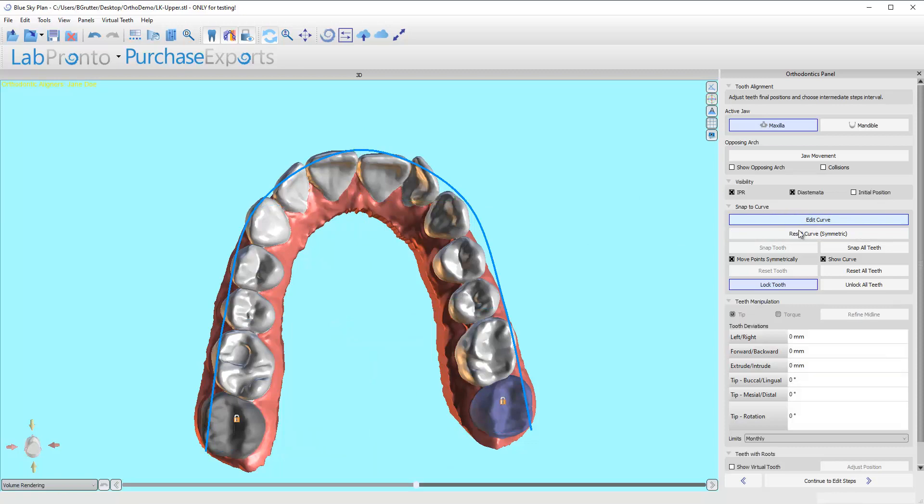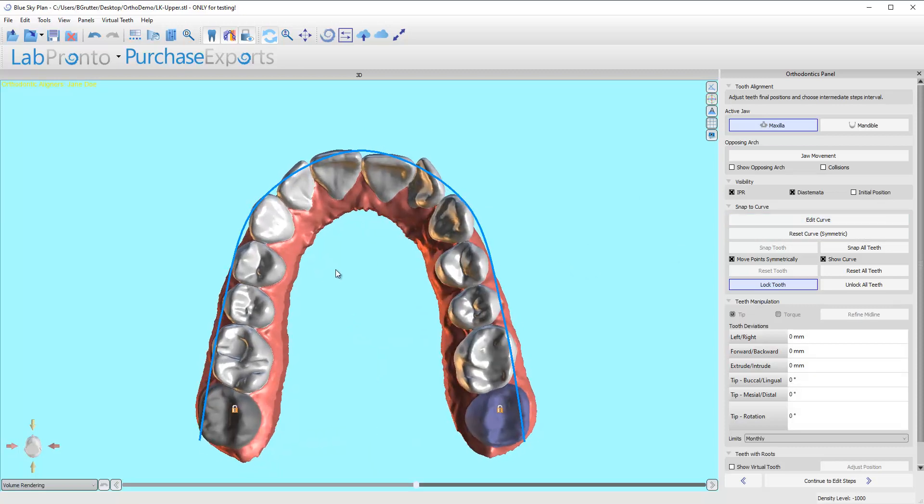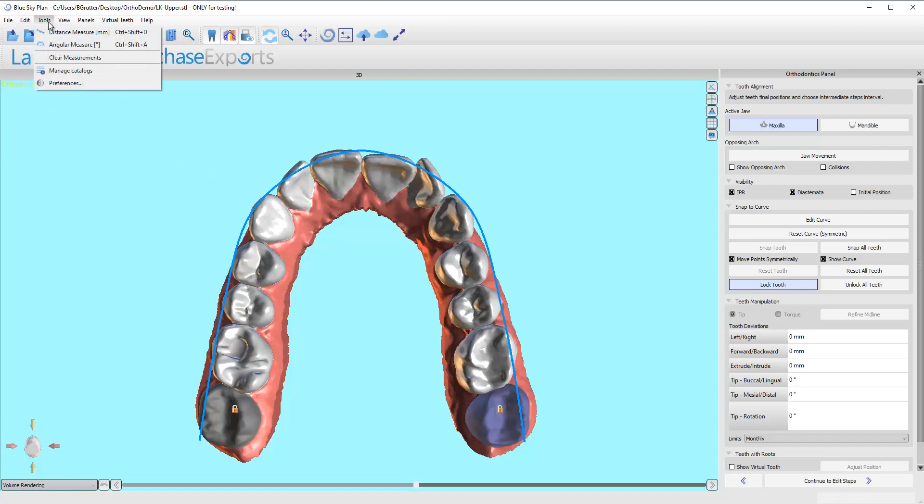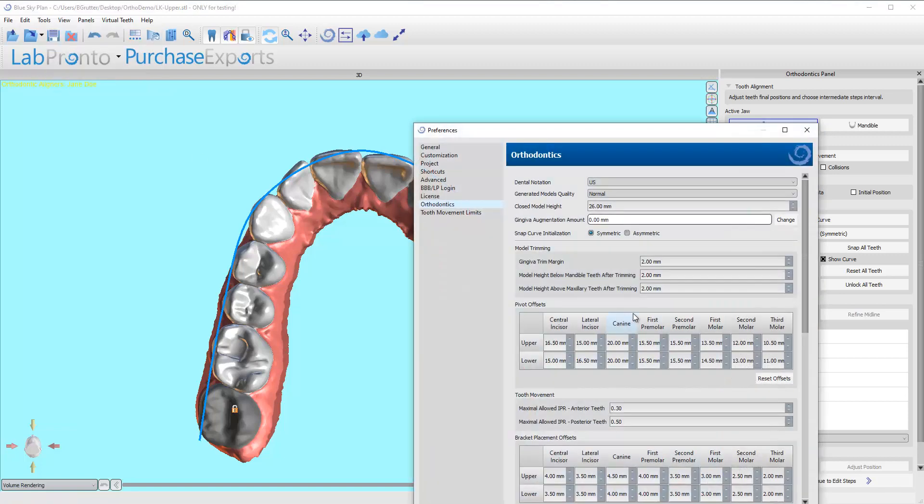Keep in mind there are some parameters that we want to go over completely here in this video. I'm going to come up here to Tooth Tools Preferences and I want to show you these two parameters right here: tooth movement.